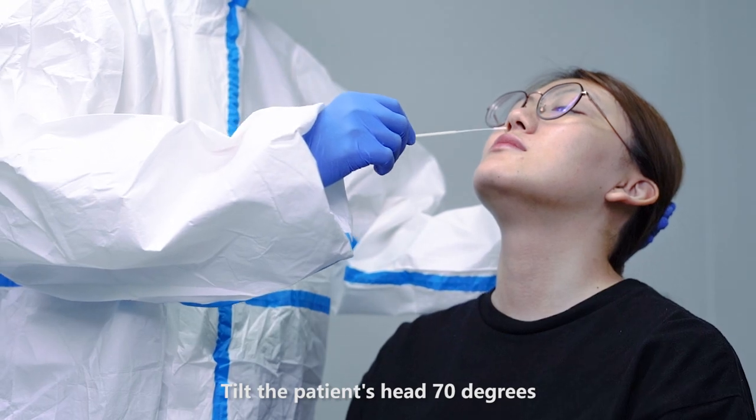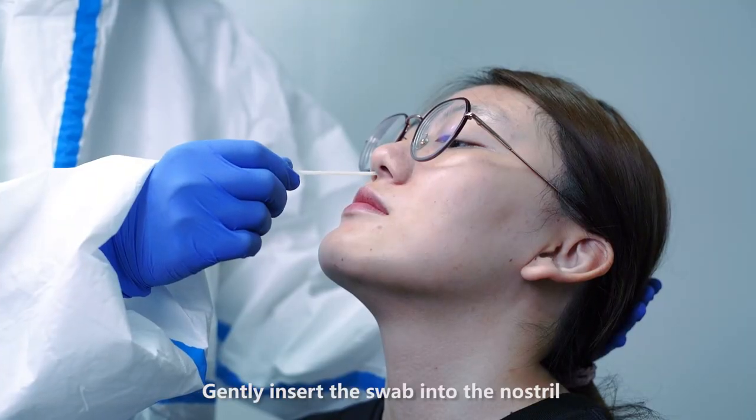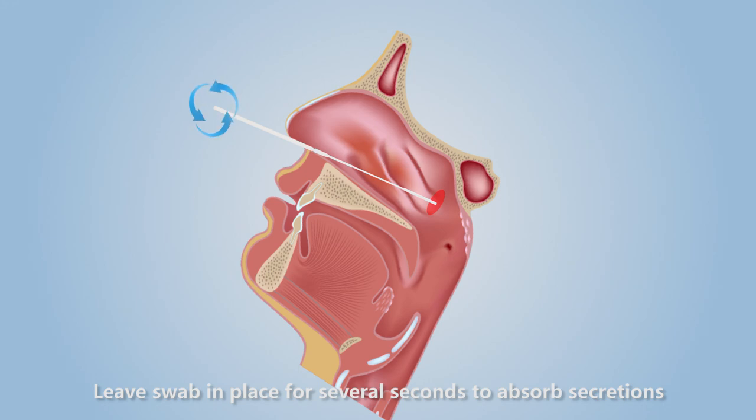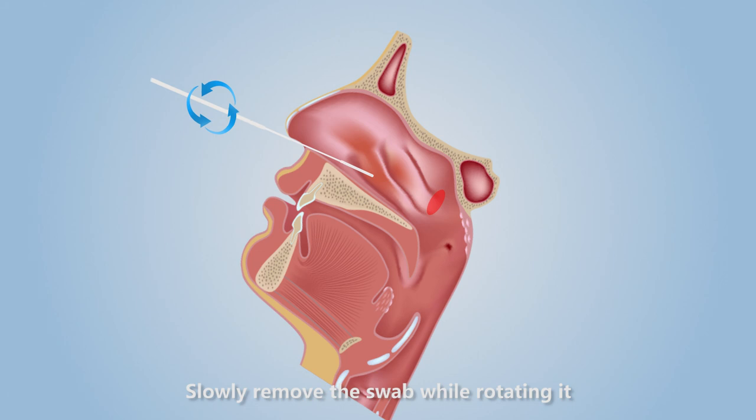Tilt the patient's head 70 degrees and gently insert the swab into the nostril. The swab should reach a depth equal to the distance from the nostrils to the outer opening of the ear. Leave the swab in place for several seconds to absorb secretions. Slowly remove the swab while rotating it.